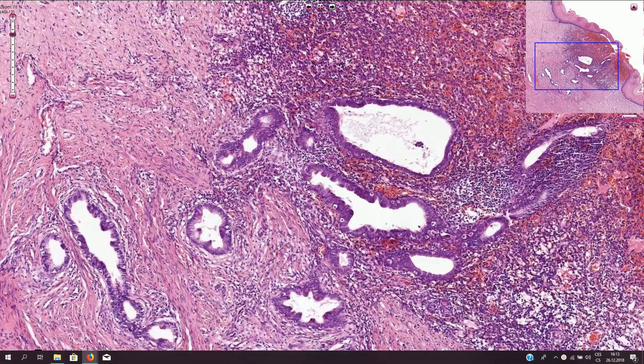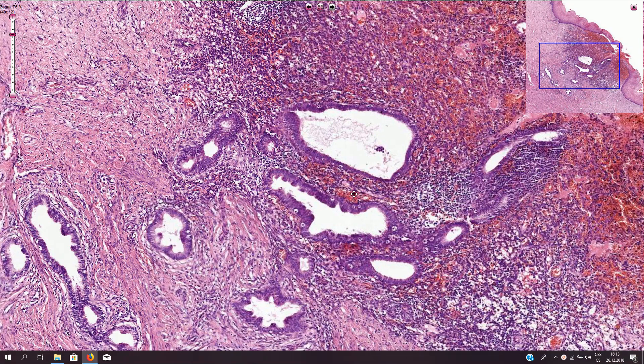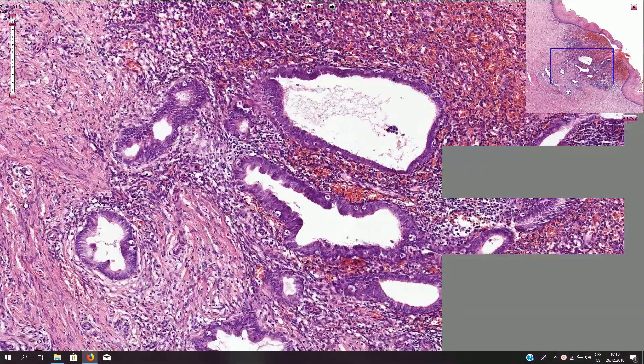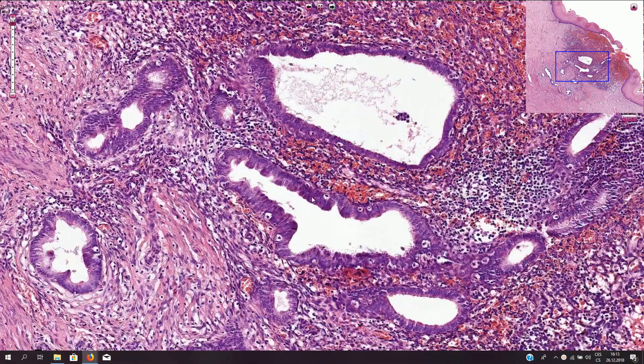These glands are lined by columnar epithelium with mild pseudo-stratification, which is a typical appearance of endometrial epithelium.